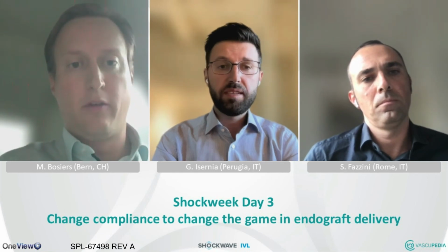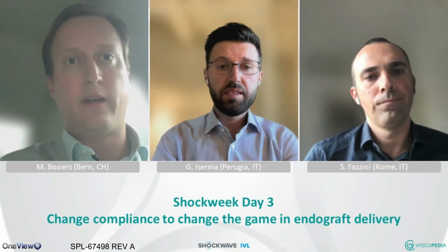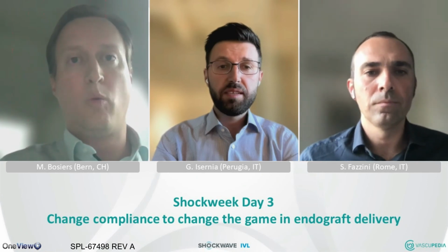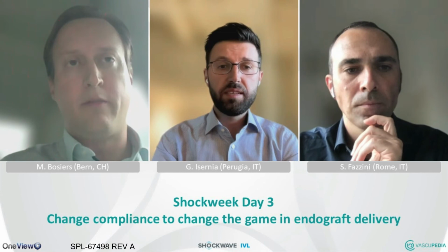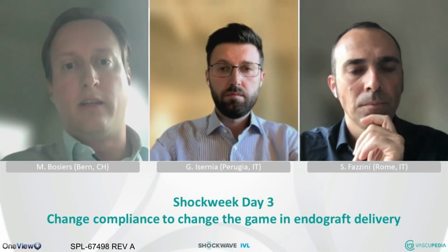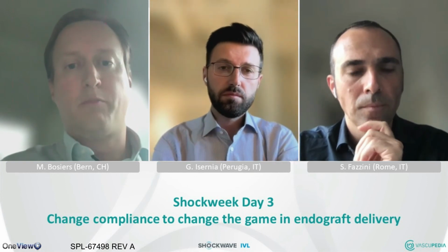I think what you said, Stefano, is very important. The problem with low profile devices is that we're using them in very thick, very stenotic, calcified iliac access. And if we don't treat it completely in a sufficient way, which at the moment we don't have a lot of alternatives besides IVL, it is one of the reasons that we see more limb occlusions than in other endografts. Is there any data that we have to support this?